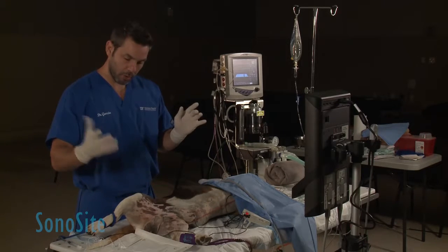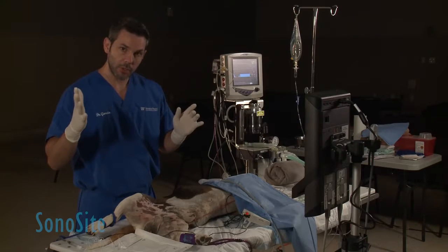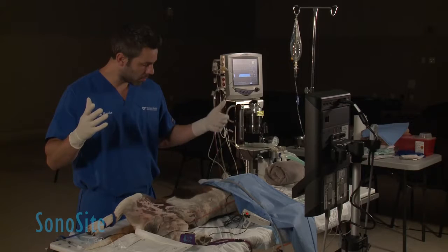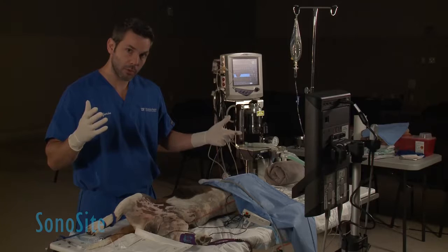My needle is sterile, and I'm going to use my right hand to be injecting, so I don't want to be touching anything but my needle to keep it sterile. When I'm using the ultrasound here, that is not covered, so my left hand is not going to be sterile.